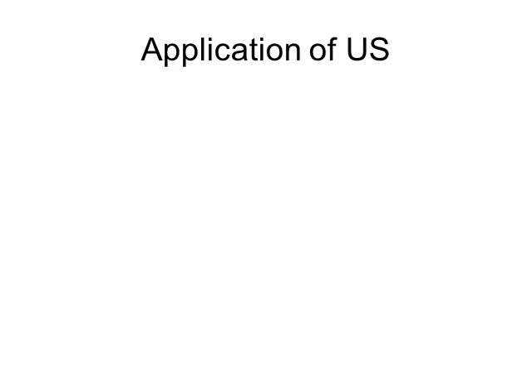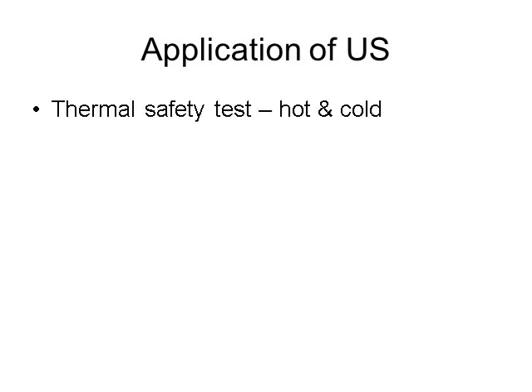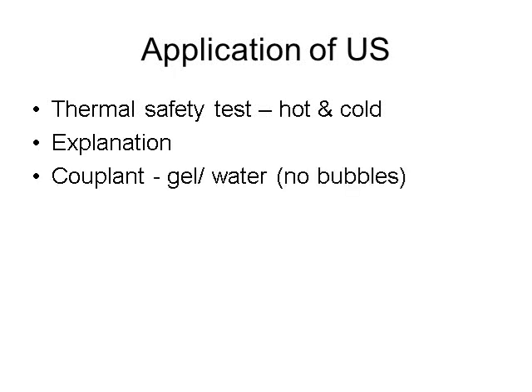The application of ultrasound is relatively simple once the therapist is familiar with the particular model they plan to use. A thermal safety test should be performed, as ultrasound may produce thermal effects. The purpose and process of treatment should be clearly explained and the patient's informed consent sought. Ultrasound may be applied using gel, which is most common, or using a water bath. In both cases, it is important to try to reduce the presence of bubbles, as this will reflect the ultrasound.